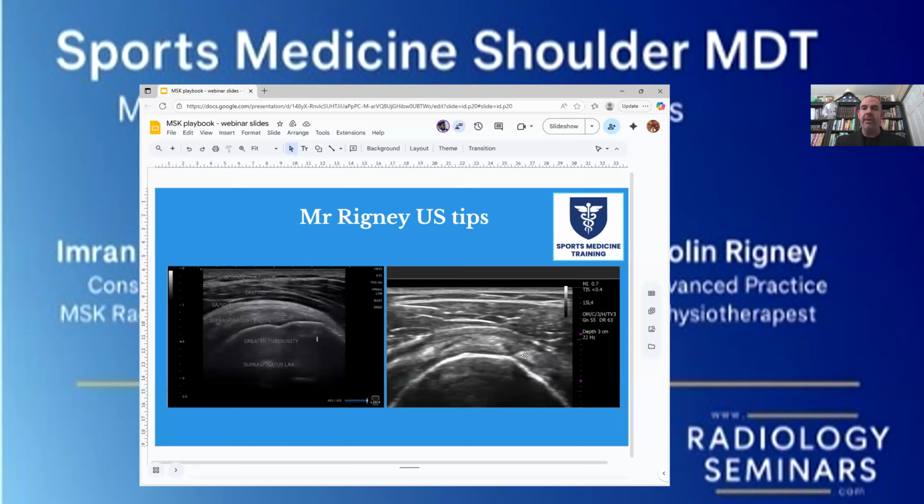So this lets me know that's medial. And then over here to the left is lateral. This is supraspinatus. And then to the right of the biceps, this would be where the subscapularis is. And in between this tissue, we have what is called the rotator cuff interval. So we have a mix of ligaments of the glenohumeral joint and the coracohumeral joint, the biceps pulley, things that hold the intra-articular portion of the biceps nice and stable through there.